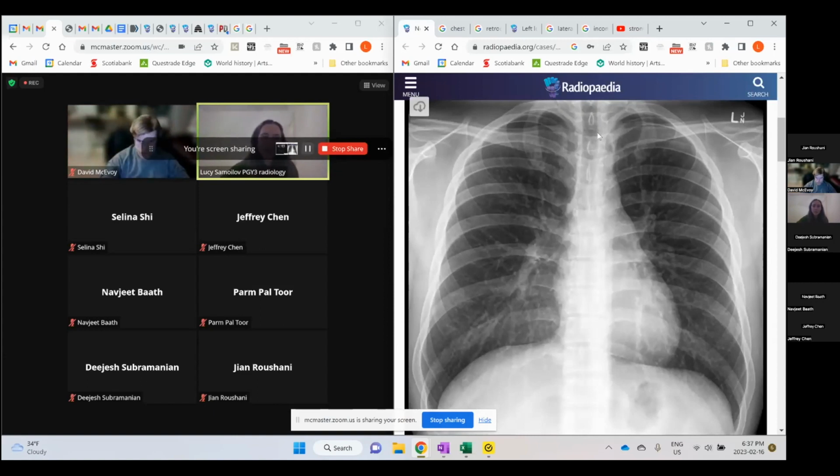In emerge, it's super useful. Internal medicine, surgery, people get chest x-rays all the time in the hospital, so it's really nice to be able to read it yourself. So I highly recommend practicing describing it, because that's the hardest part.